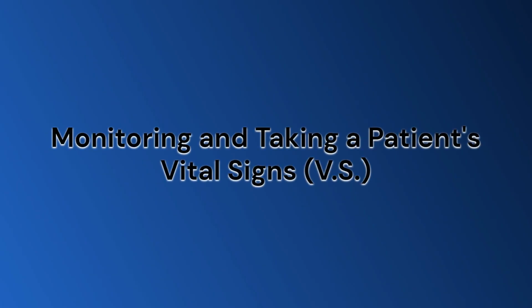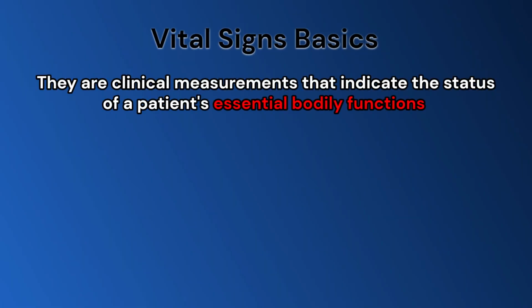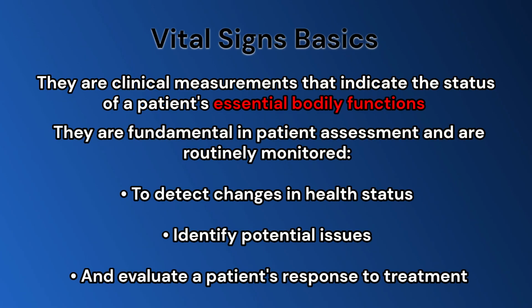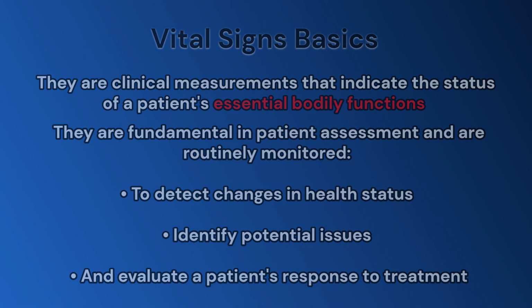Monitoring and taking a patient's vital signs. Vital signs basics. They are clinical measurements that indicate the status of a patient's essential bodily functions. They are fundamental in patient assessment and are routinely monitored to detect changes in health status, identify potential issues, and evaluate a patient's response to treatment.